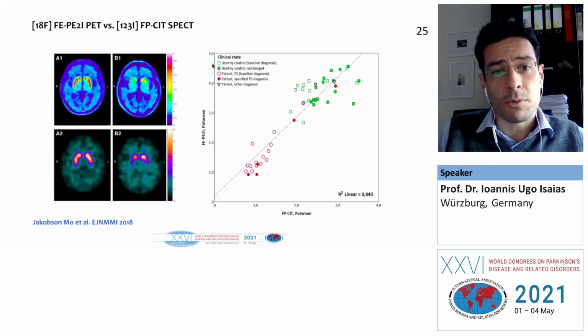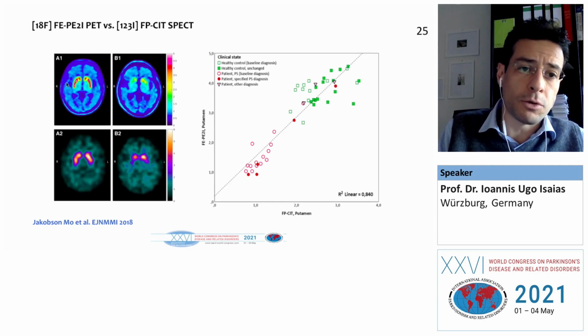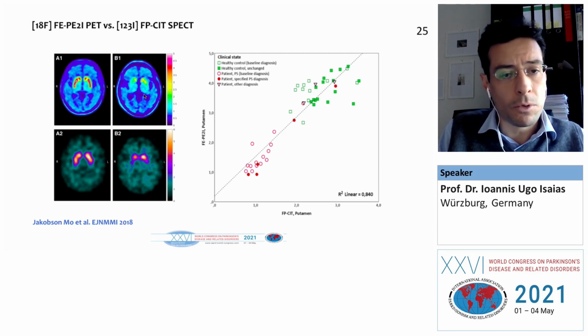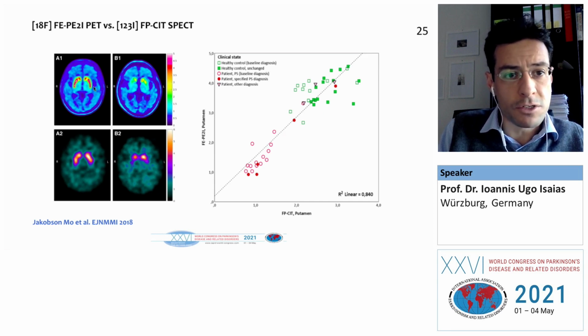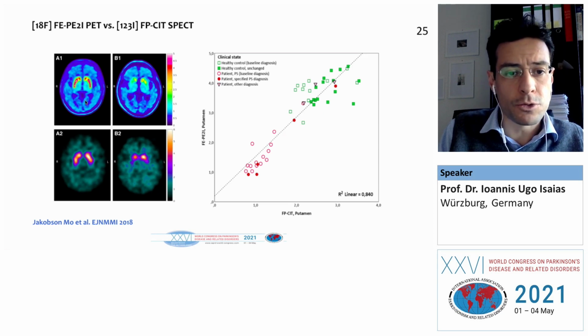What comes next from research, and this has been intense research of the group of Halldin, Karolinska Institute, is having available PET ligands targeting the DAT. And this is one of the most recently developed, which is called PE2I. And here you can clearly compare the two images. The PET images are much more defined. You can clearly distinguish the caudate head from the putamen in these two patients.